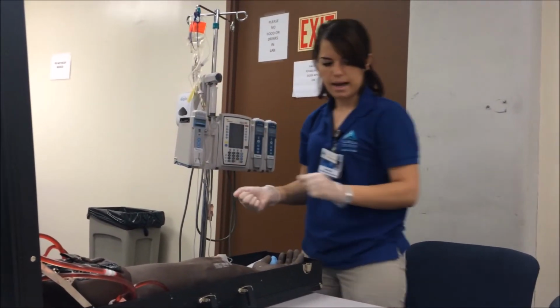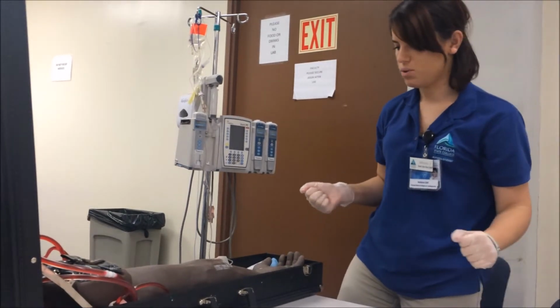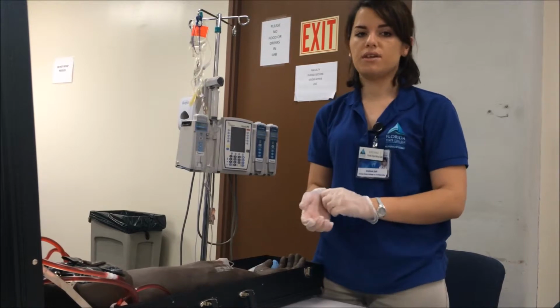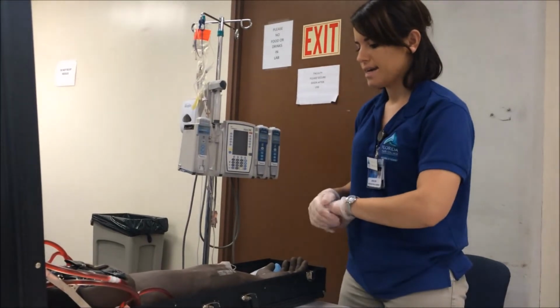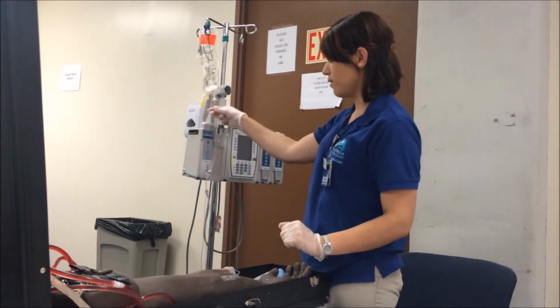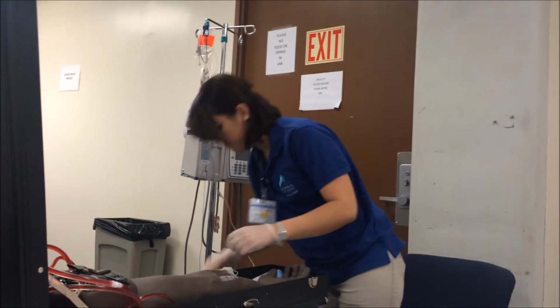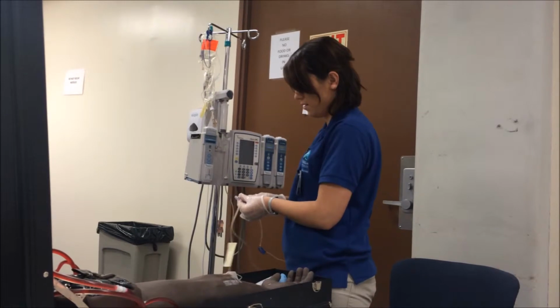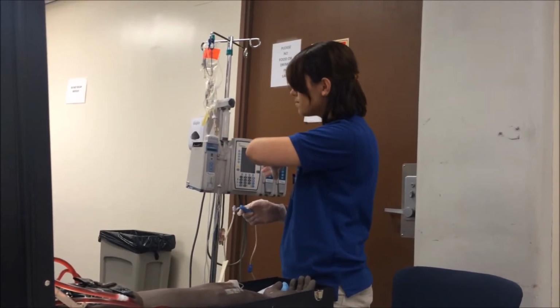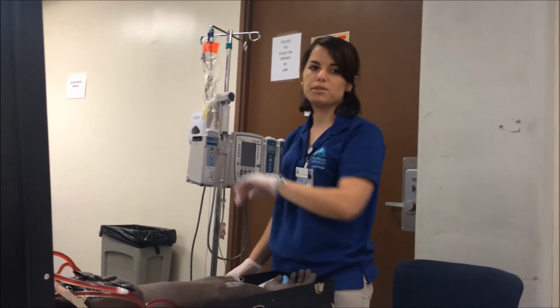Okay, and now at this time I'll make sure to once again look at my patient's site to see for any adverse reactions. And before I do that though, I'll make sure to reestablish my flow rate for my primary for 1 moment. And my flow rate has been reestablished.